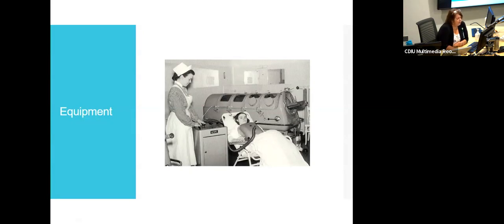Well, at some point, you need to have some nursing care done, maybe a bath or a bed change. So you can't stay in this all the time. So then these types of devices, these turtle shell type devices called cuirass devices, are hard shells which the patients would wear, and they're attached very simply to something that would be a piston on the back and front stroke.